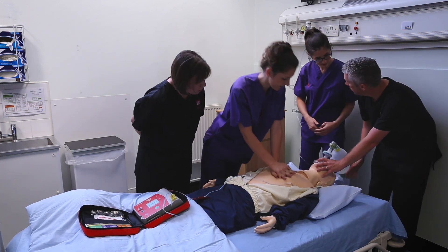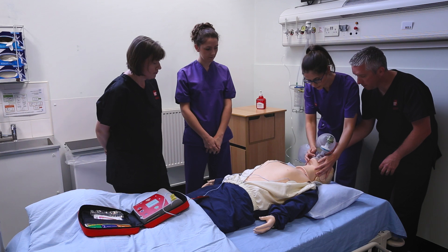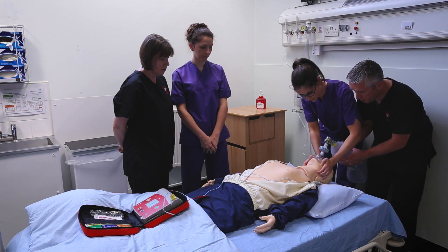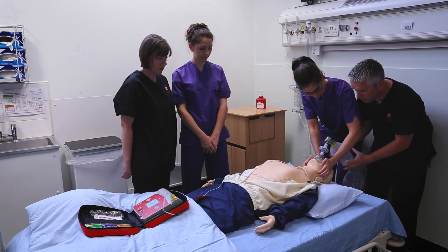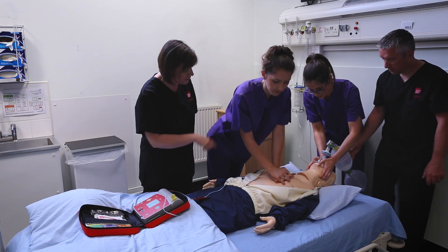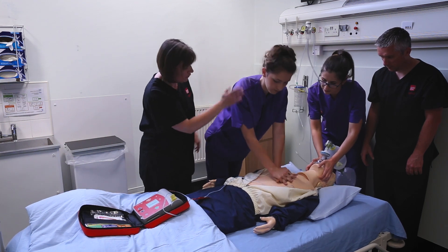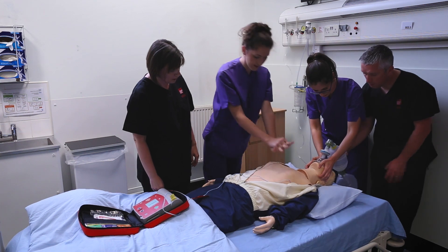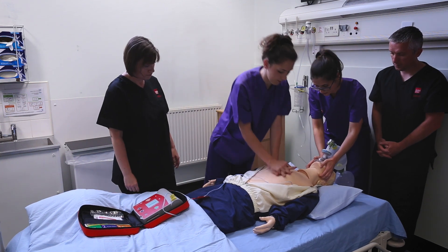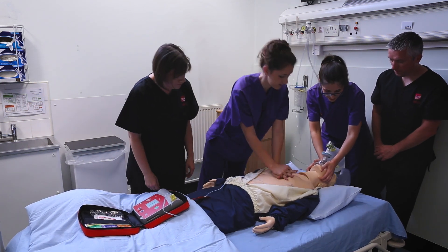Back on the compressions. Place the mask on the patient's face, heels of your hands on the mask with fingers at the angle of the jaw. Two breaths. Back on the chest — at 100 beats per minute, 30 compressions to two breaths. Keep your elbows locked and the weight coming through your shoulders. How far down on the chest are you going? About five centimetres. Because all you're doing is holding this airway open and the flow of oxygen will provide the patient with some oxygen.